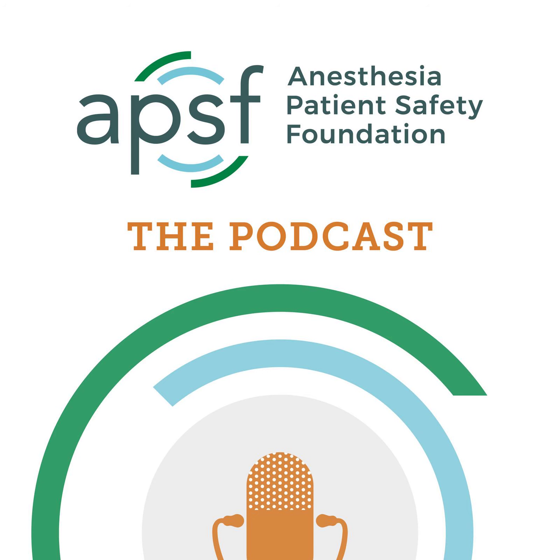Thank you so much to Schwartz for helping to get this show started today. The article starts off with some history. Did you know that the LMA was invented in 1983 by Dr. Archie Brain to function as an alternative airway device to the face mask and endotracheal tube? The LMA has a role in airway management since it may be able to provide better quality ventilation than the face mask, as well as less instrumentation of the airway than placement of an endotracheal tube.